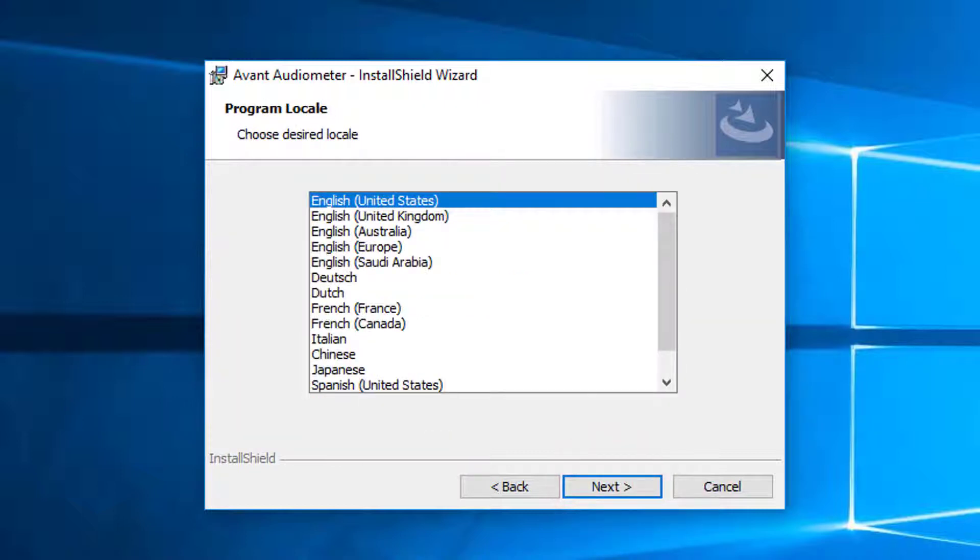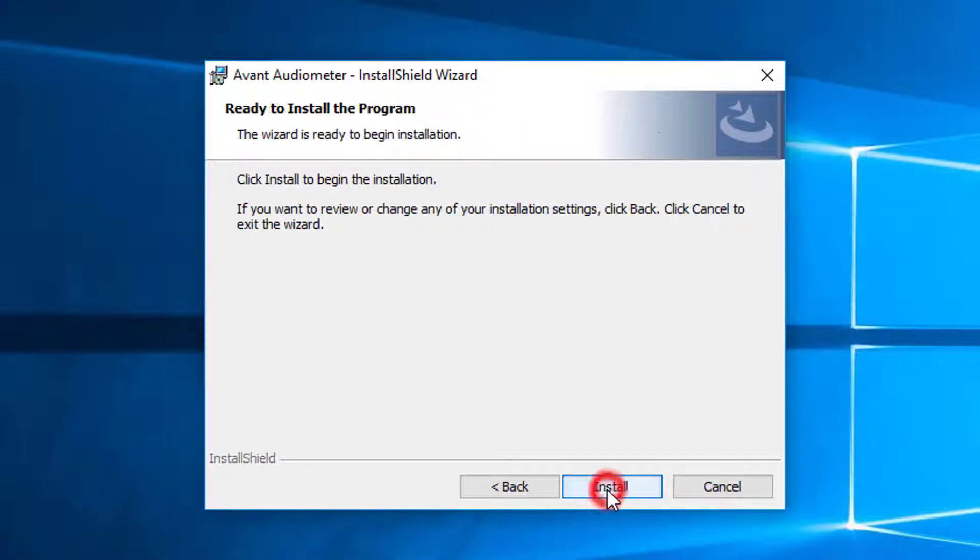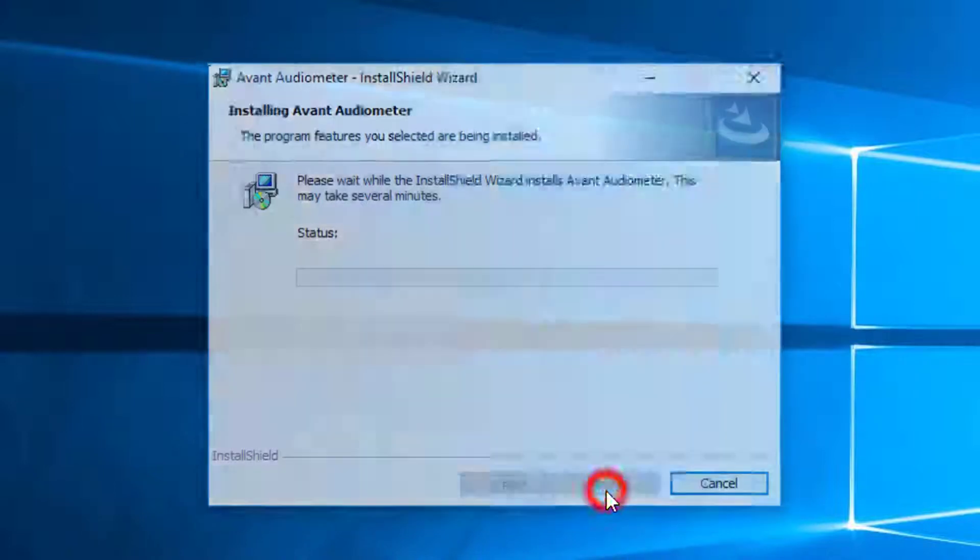This screen sets the language and location of choice. Click Next. This screen indicates the location of the program files. Click Next. Installation of the program is ready to start. To continue, click Install.